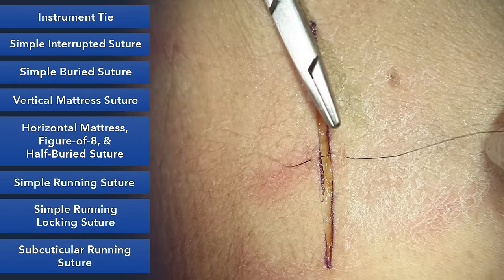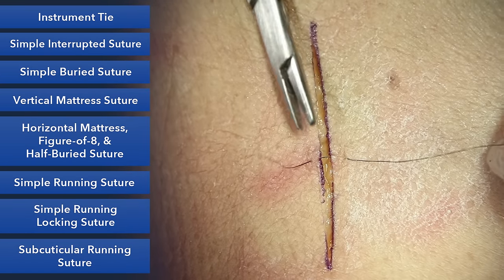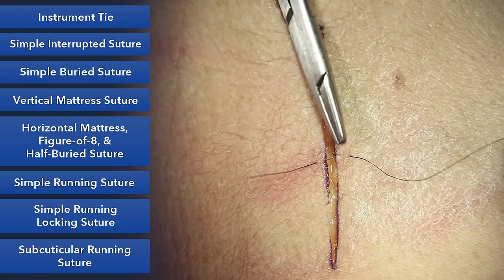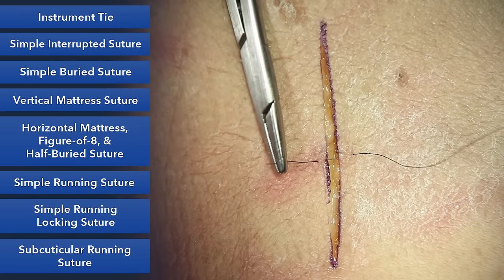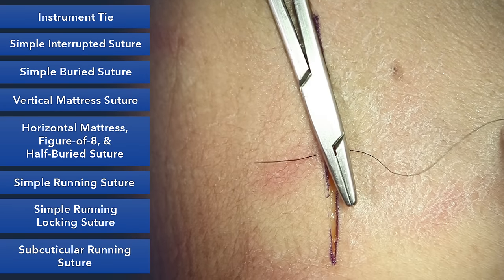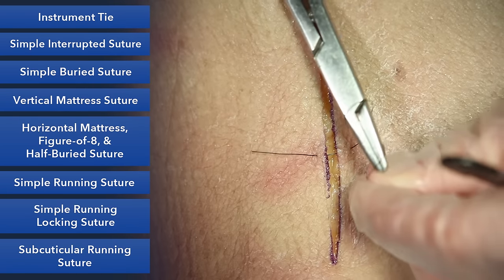Before we get started showing you different suture techniques, I want to show you a basic instrument tie. This can be used with any of the suture techniques that you'll learn. Once the suture is placed, you'll have a short end and then a longer loop end. Your needle driver should be placed directly between the two, and then we will do a surgeon's knot.